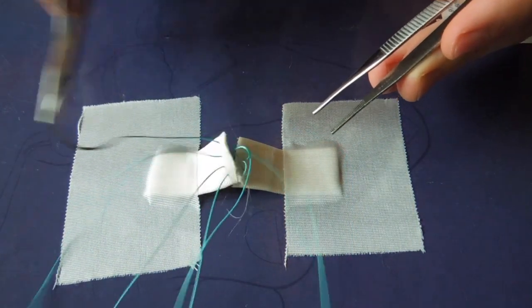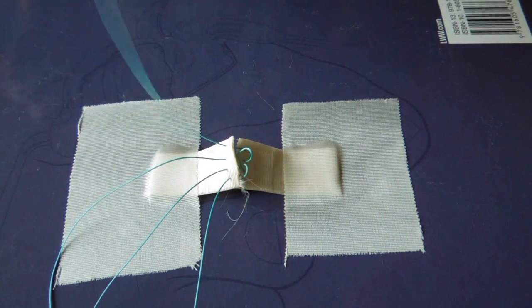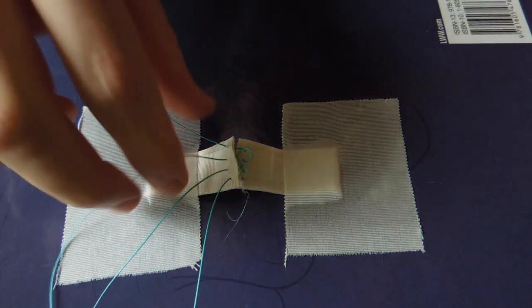So that's what we've done here. We've thrown our first one, we've got a second piece of suture, and now we've thrown our second pants over vest suture. So we have both lined up.